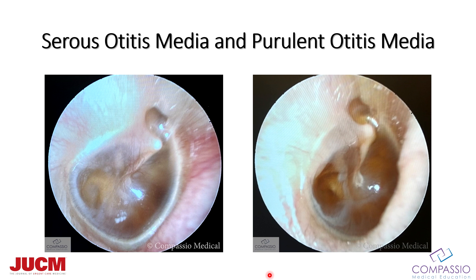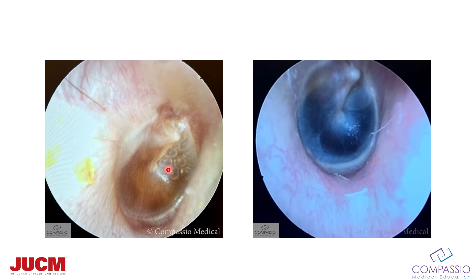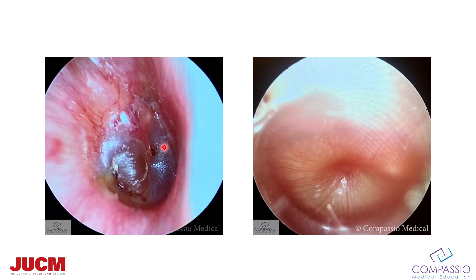Serous otitis media can come in numerous flavors. Look at this patient — very subtle amber fluid with a meniscus. This is normal TM above, fluid from here down. Over here we've got a middle ear full of serous amber fluid. Here there are bubbles with amber fluid. And look at this right ear — it's almost blue, but that again is just middle ear fluid. This patient came in with a right ear and I thought it was pus, but I was wrong — this is actually fluid under pressure.